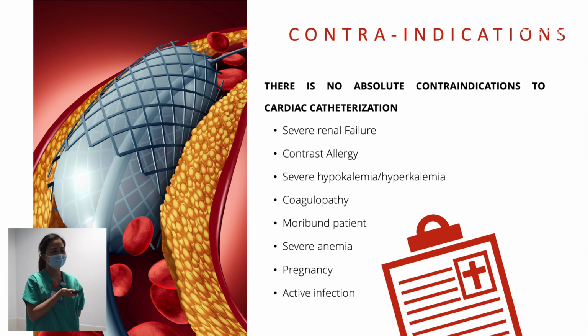So next is contrast allergy. Of course, we always ask the patients if they're allergic to anything. If they're allergic to contrast, we give them medications, and we will discuss more about this later on. Next is severe hypokalemia or hyperkalemia, or any electrolyte imbalances, because of course they can induce dysrhythmias during procedures and even cardiac arrest.